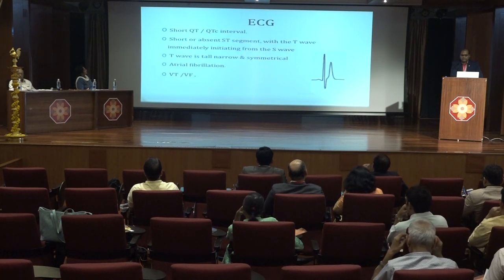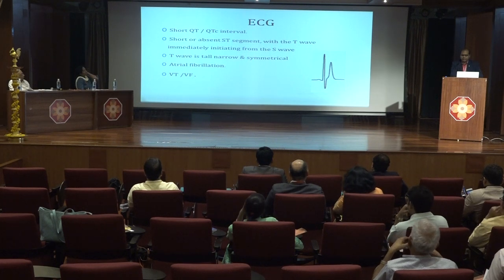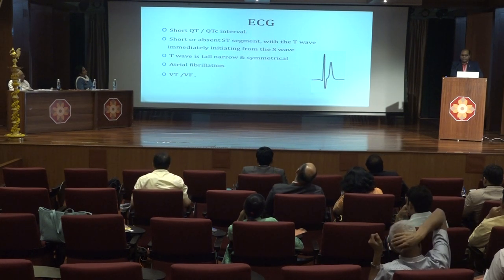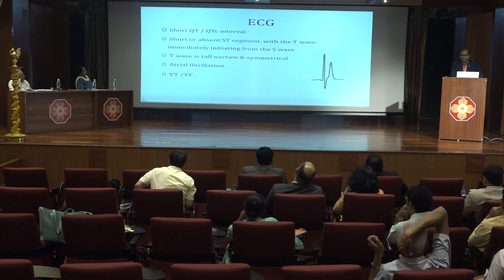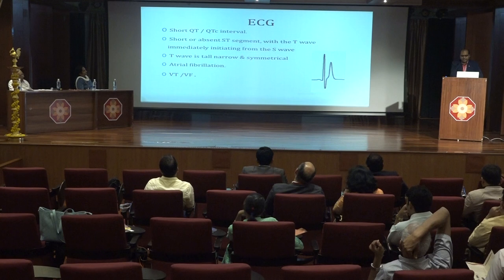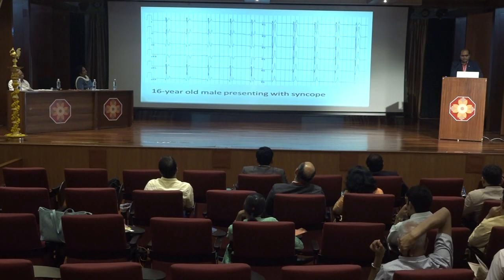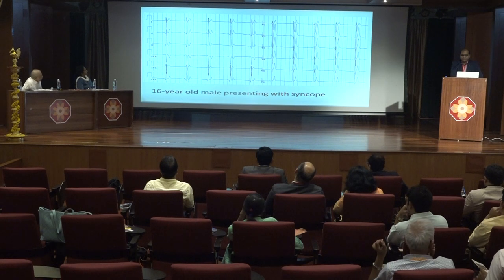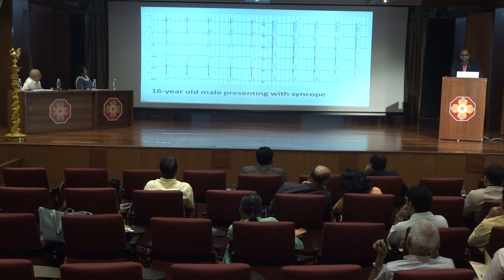The ECG in short QT syndrome is very characteristic: the QT interval is short, the ST segment may be short or absent, and the T wave starts immediately from the S wave. The T wave is tall, narrow, and symmetrical. Patients may have atrial fibrillation, VT, and VF. This ECG from a 16-year-old presenting with syncope shows short QT and the tall, narrow, symmetrical T waves.